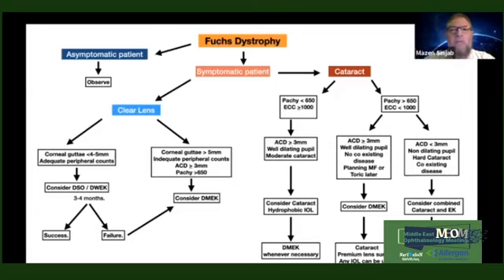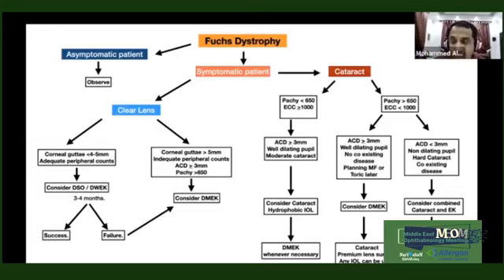If we put the glycerine drops in the eye and we wait for about 10 to 15 minutes, the cornea will lose this huge thickness, then we can get better K readings and we can get a better endothelial cell count. So I'd like to hear the opinion of my colleagues. We can ask Fogla because he is the one who started this.